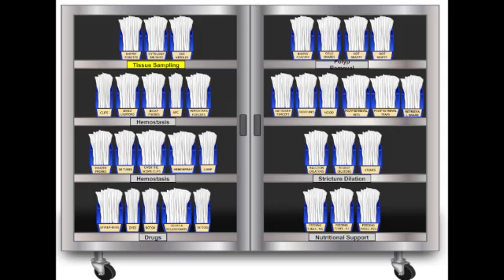Cold snare first. Cold snare. Simple. No electricity involved. It's basically a wire loop you close around a polyp and cut it off mechanically. Where do you use it? Standard for removing smaller polyps in the colon, typically in the 4 to 10 millimeter range, especially non-pedunculated flatter ones. The idea is less thermal injury means potentially lower risk of delayed bleeding compared to using current.